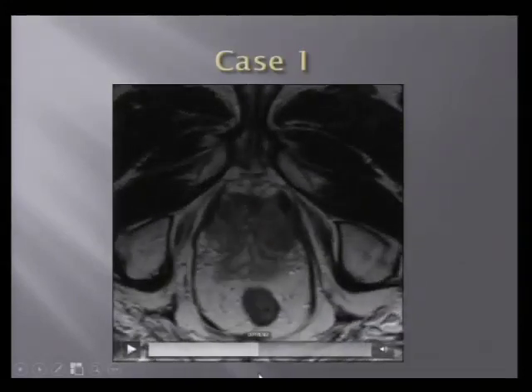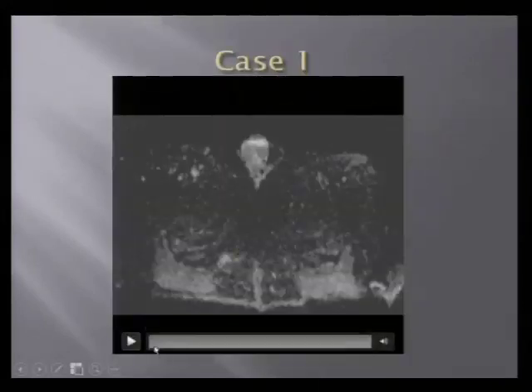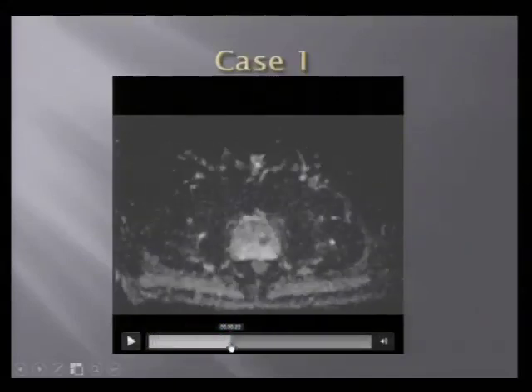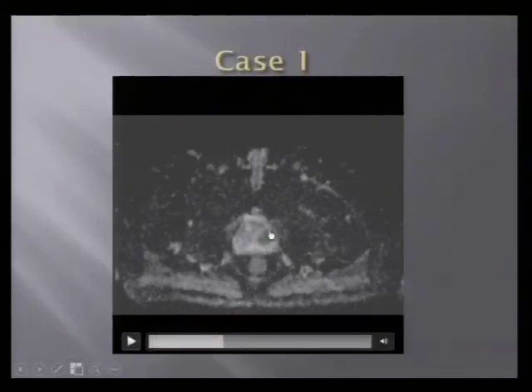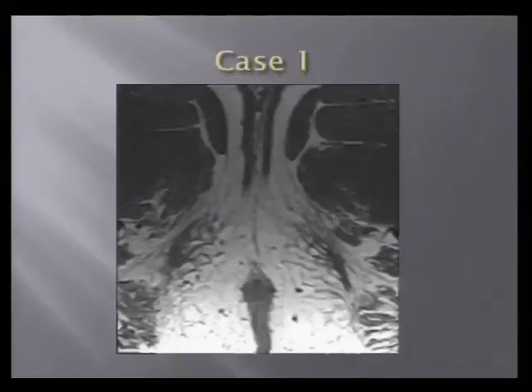And you can see you certainly have BPH, like you always will. But if you look over here, this should be the peripheral zone all the way out here, and it just kind of stops. So here's that ADC map I was talking about that gives us information about diffusion weighted imaging. And look right there, it's dark right there. So now all of a sudden I have two of the different parts of the multiparametric imaging that are positive for cancer in this region.